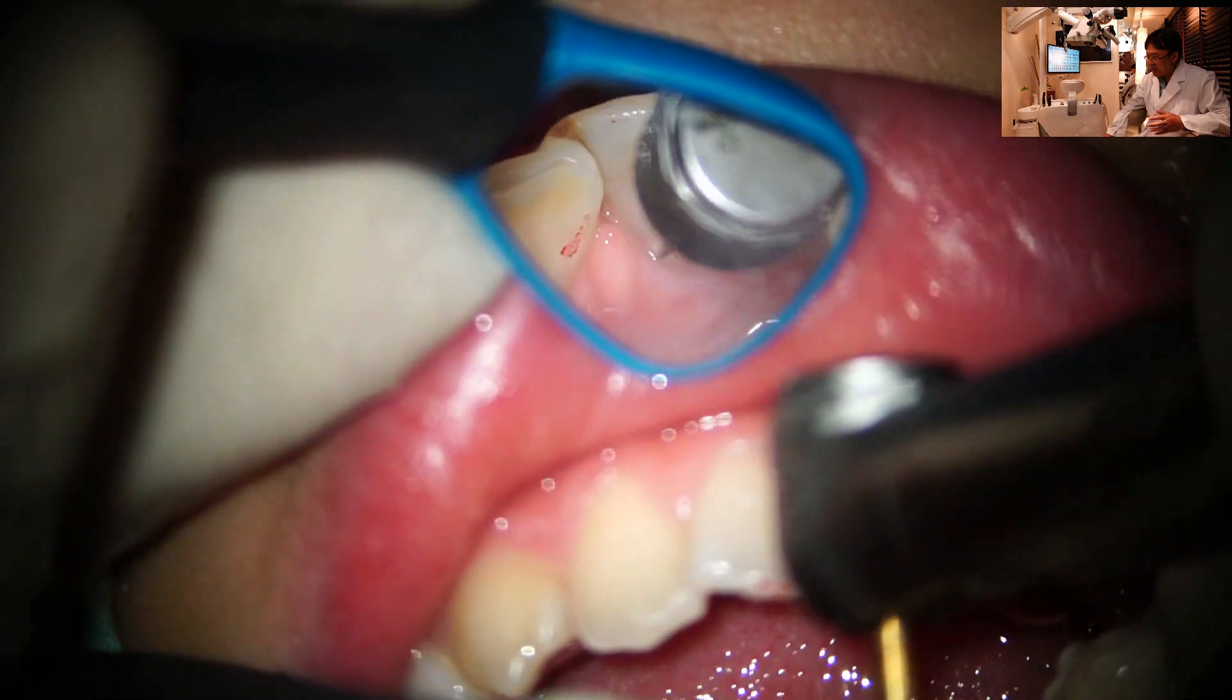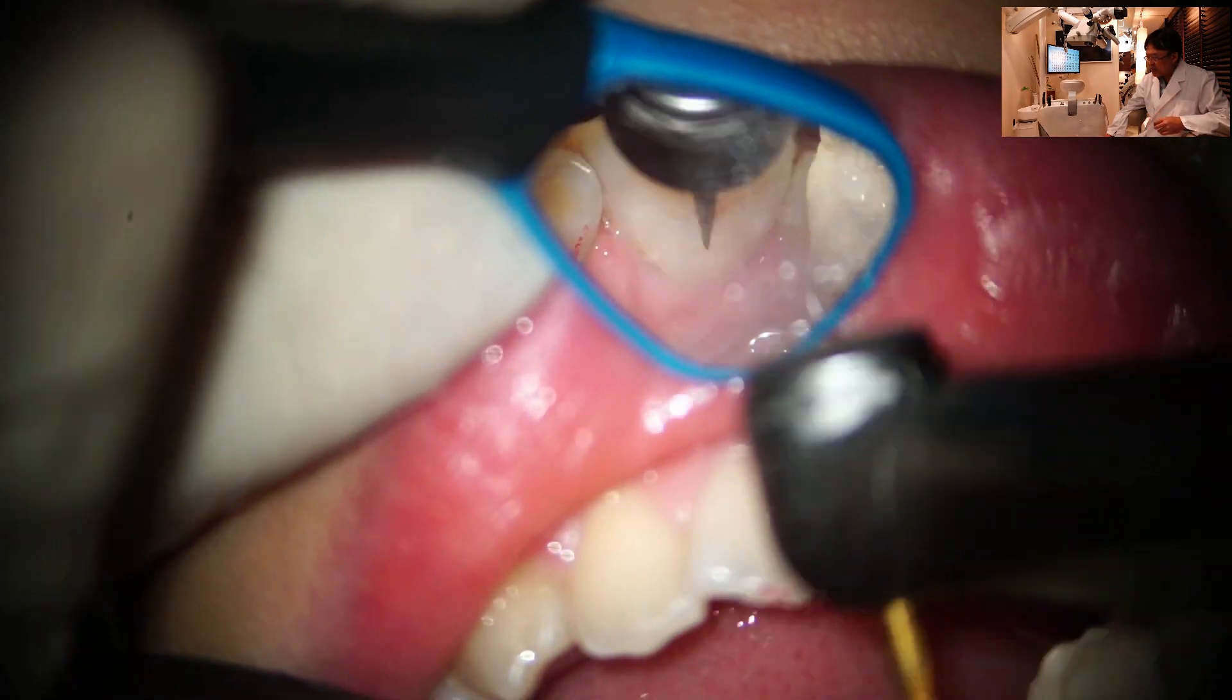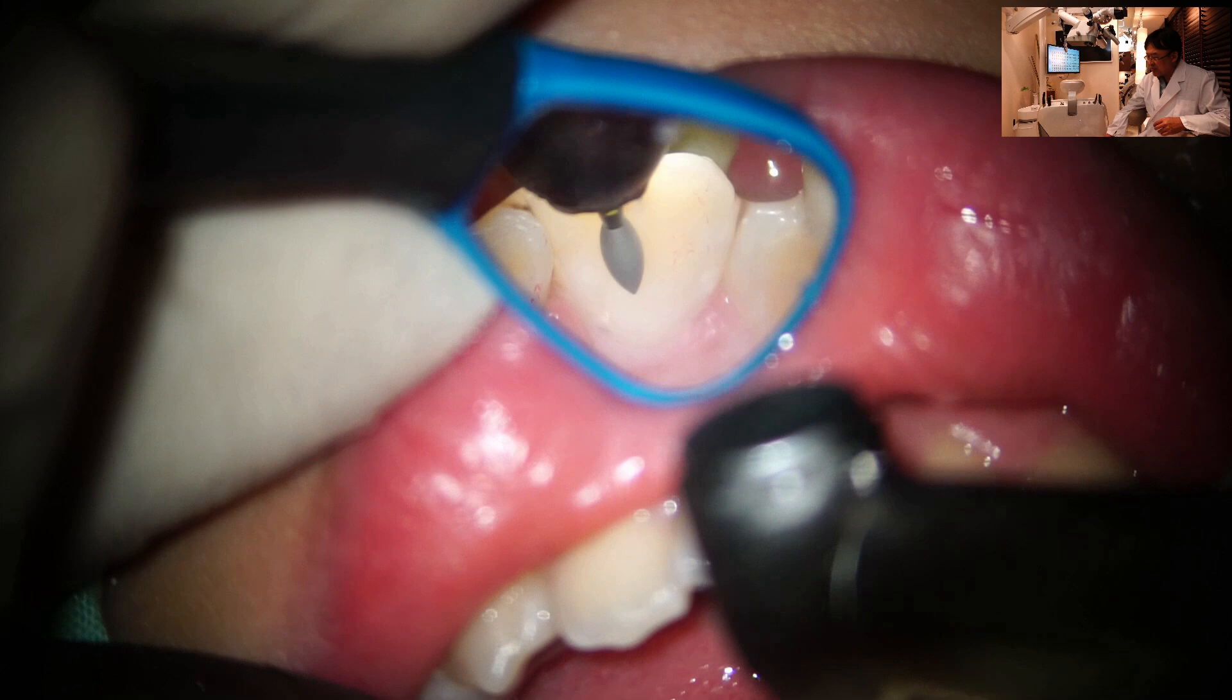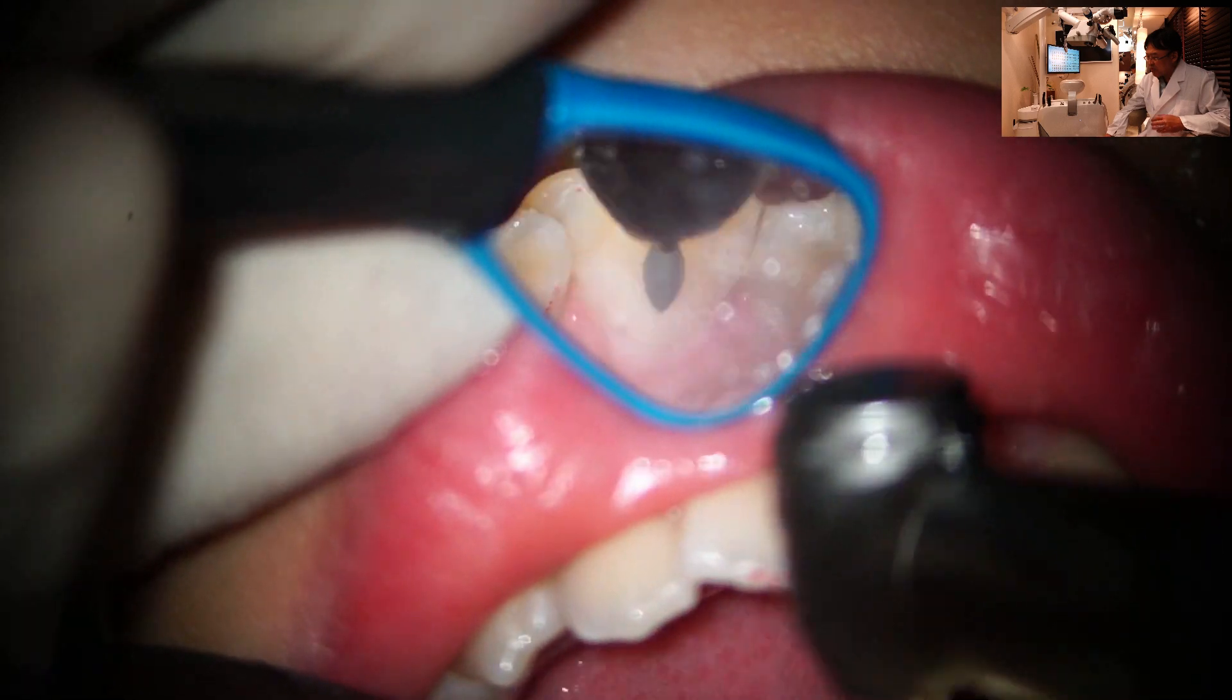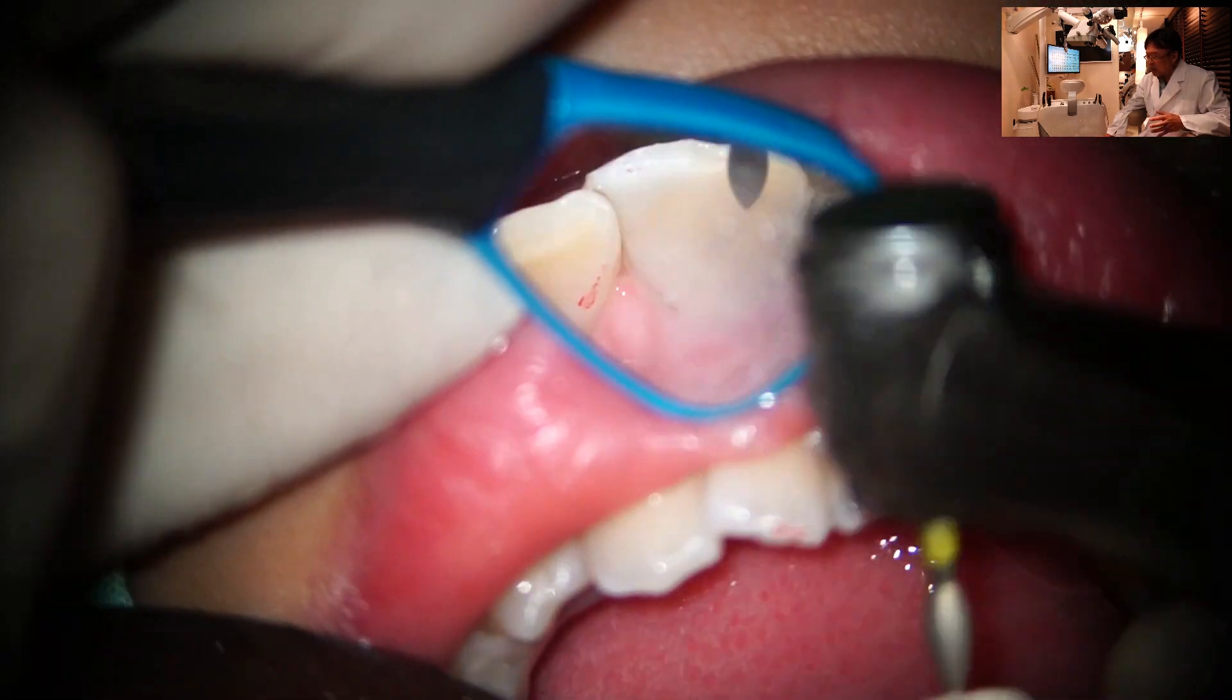And I'm checking the occlusion and reducing the occlusion with a diamond bur.